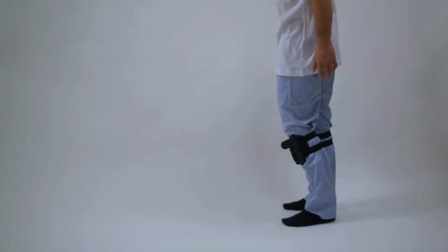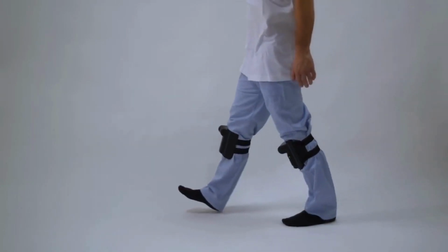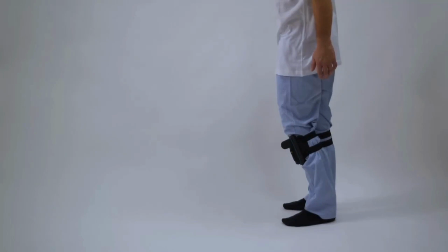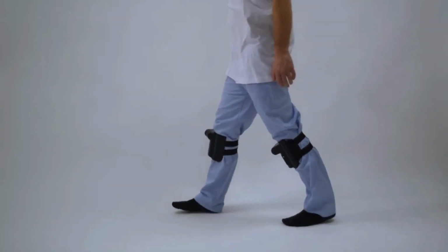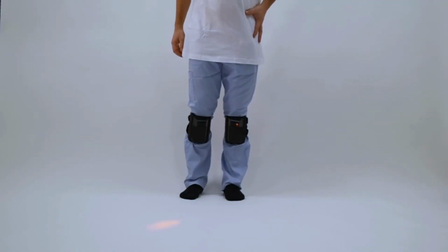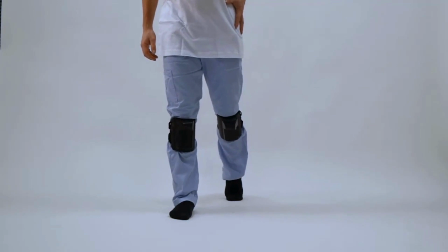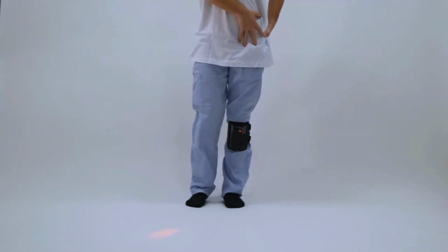Hip extension. Exercise to be performed in a static position, so the patient is not required to advance. Feedback is used to increase awareness of the body's attitude in search of correction of the compensatory attitude of hip flexion. In this exercise, we take advantage of the switching off of the feedback related to knee flexion resulting from hip flexion.